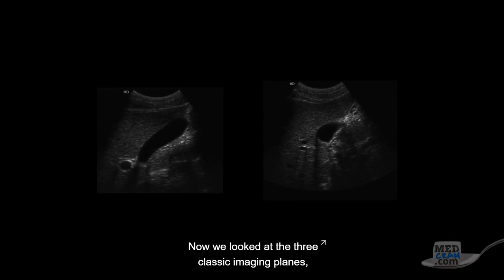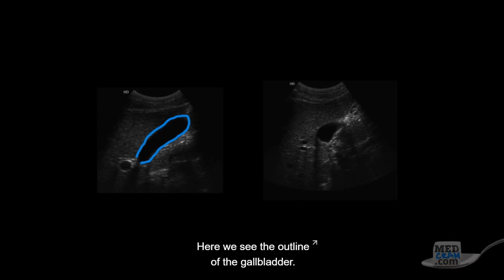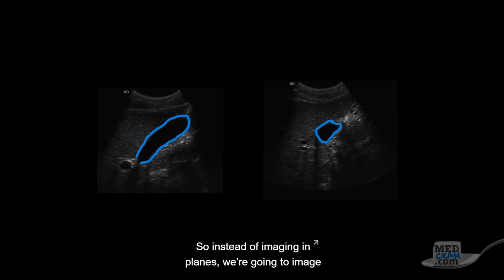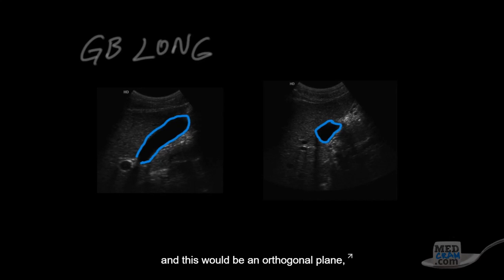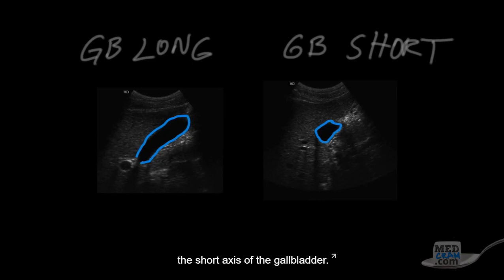Now, we looked at the three classic imaging planes, but sometimes structures do not lie in those classic planes. An example is the gallbladder. Here we see the outline of the gallbladder, and the gallbladder does not sit in the same plane on every single person. So instead of imaging in planes, we're going to image in long and short axis in relation to the structure. So this would be the long axis of the gallbladder, and this would be an orthogonal plane, or 90 degrees from that long axis, and it's going to be the short axis of the gallbladder.